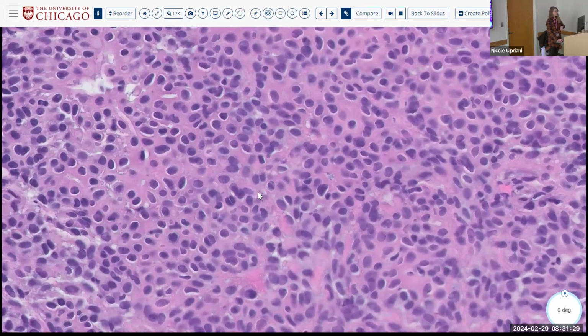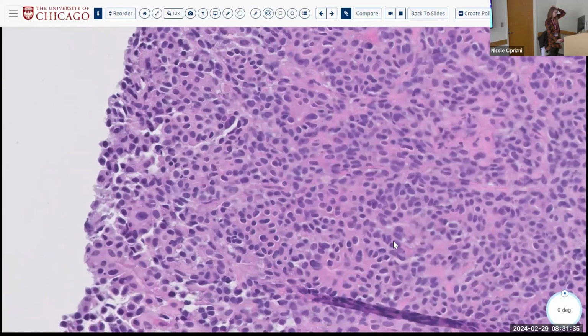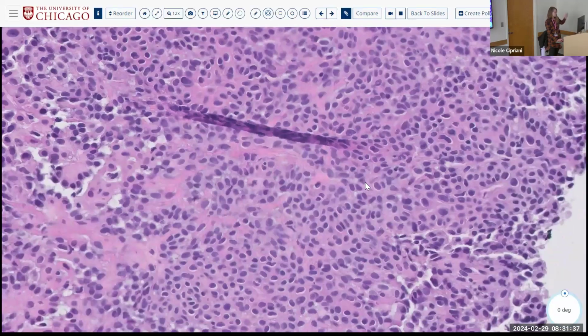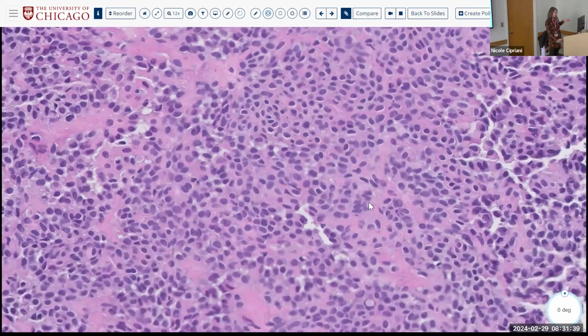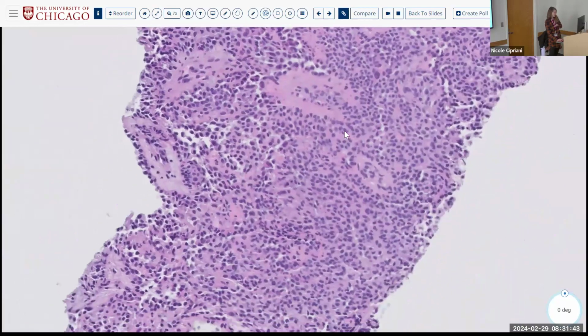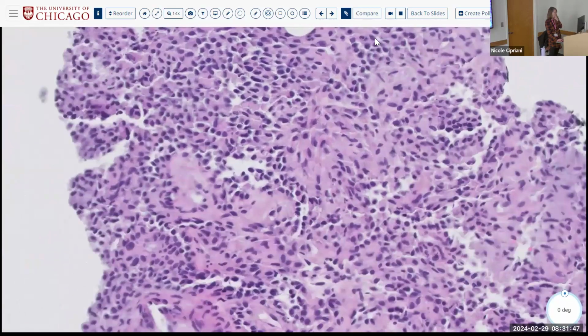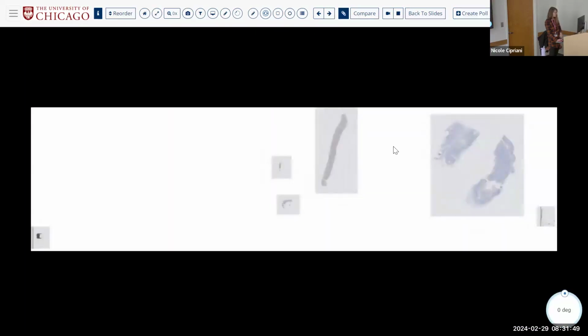So it doesn't really look like that characteristic adenoid cystic pattern with wrinkled nuclei, with cribriform architecture, okay? So we've kind of knocked that out, but we could think of something else biphasic, like an epithelial-myoepithelial carcinoma, like a PA, or something monophasic, if we can't prove that those are ducts, right? So you could think about a monophasic neoplasm.